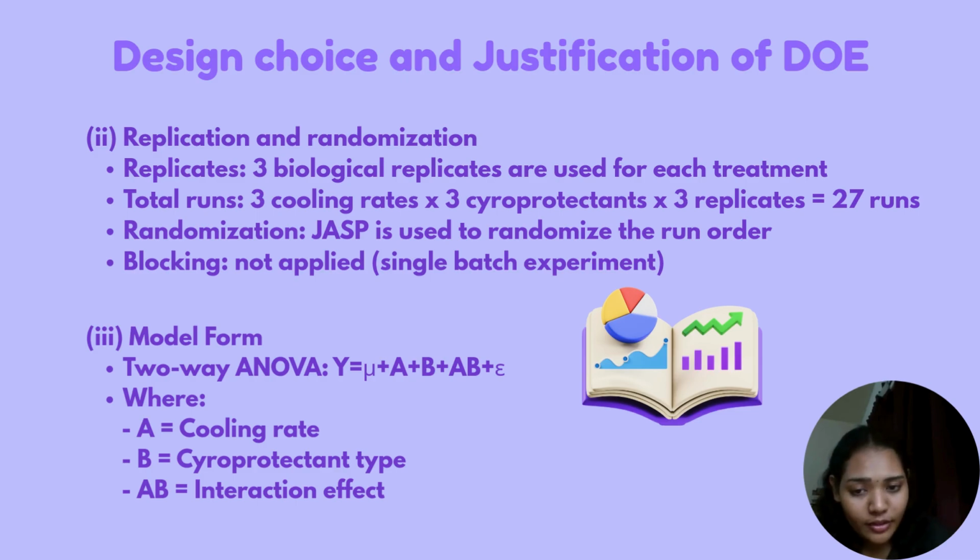And lastly, in this DOE, blocking is not applied as this is a single batch experiment and all samples are assumed to be homogeneous. It is appropriate because this experiment is conducted on the same day by the same operator using the same equipment and reagents. Thus, blocking would be unnecessary and it would reduce the degrees of freedom.